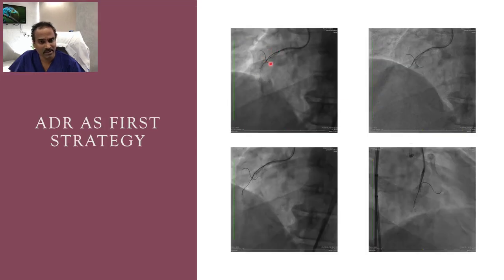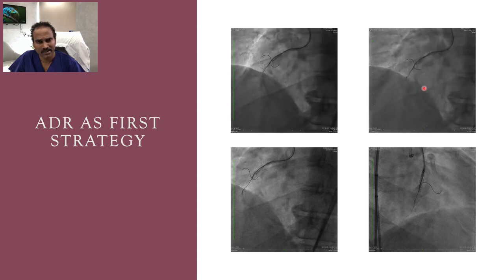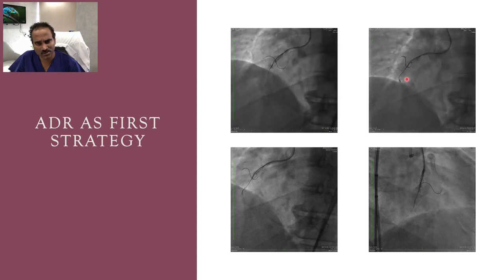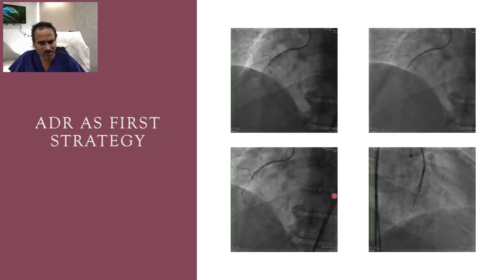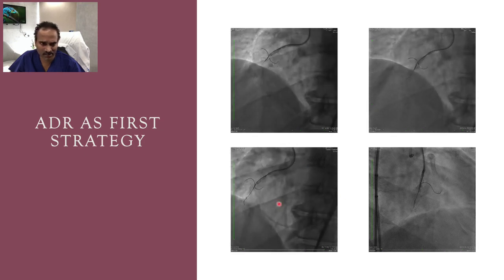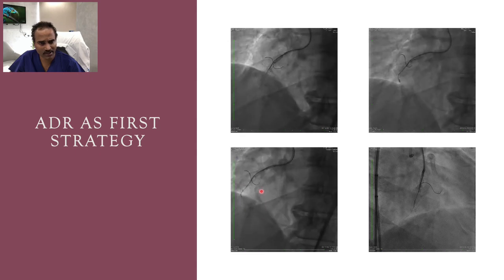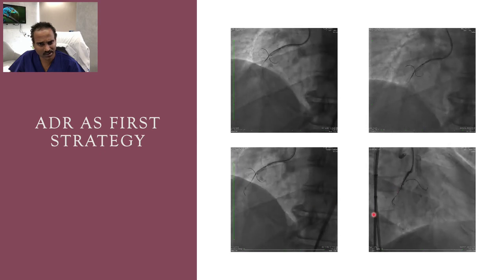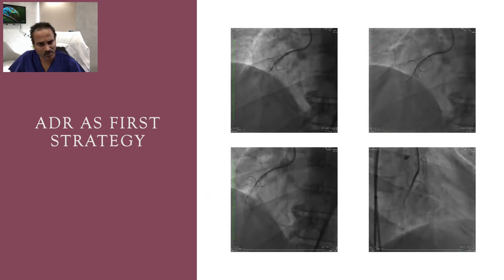We did trapping of the microcatheter with, I think, a 3 by 12 balloon, and then we took a Fielder XTR wire and knuckled it, but unfortunately that knuckle went into the side branch again and again. Then we widened the knuckle, but despite the wide knuckle it only went into the side branch, which we can appreciate in both RAO and LAO views.